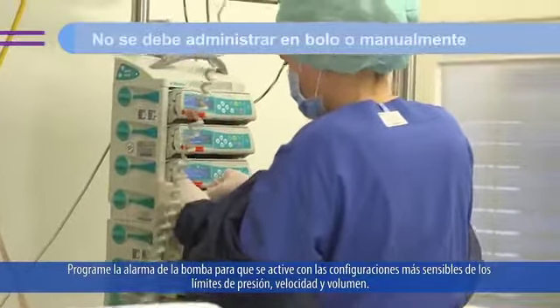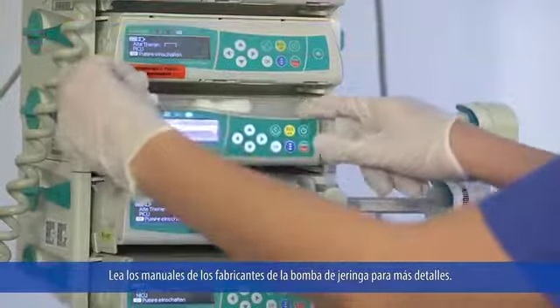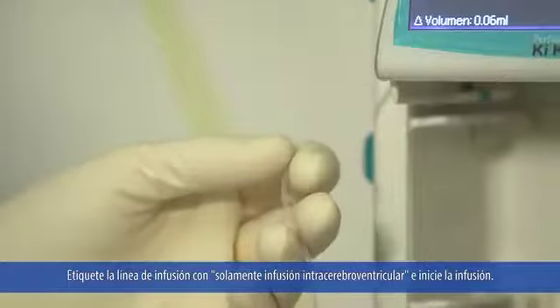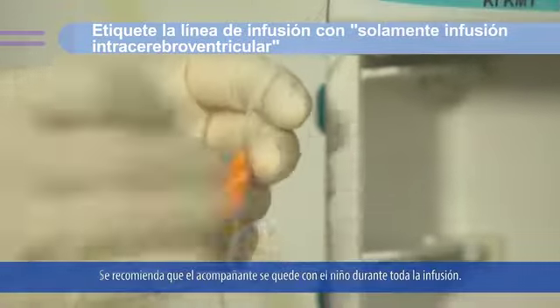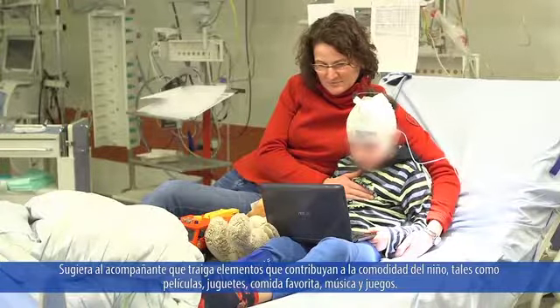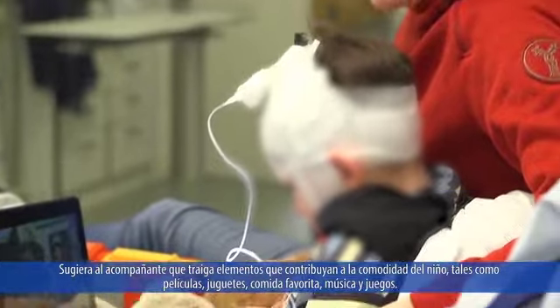Set the pump alarms to sound at the most sensitive settings for pressure, rate, and volume limits. See the syringe pump manufacturer's operating manual for details. Label the infusion line for intracerebroventricular infusion only and initiate the infusion. It is recommended that a caregiver stays with the child at all times during the infusion. Advise the caregiver to bring items to help comfort the child, such as movies, toys, favorite foods, music, and games.